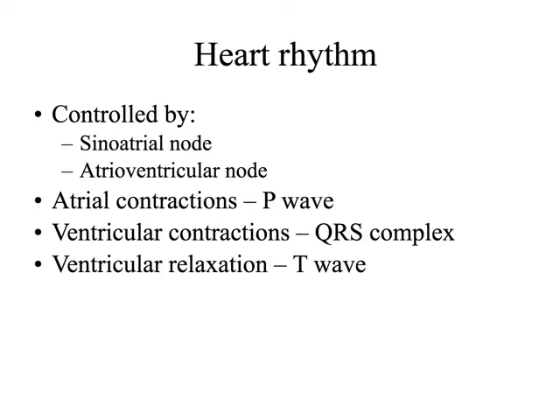They were saying that's how they gate. It's like because they have to watch the heart for so long to make sure that the heart rhythm doesn't change up and down too much. And they said they start with the P, they watch the P wave, and then the machine just looks at that rhythm, and then just sets the gating based off of whatever that was. That makes sense. It's kind of like doing abdomen MRI. It watches when they're not breathing, like when they're exhaling, before it scans. Yeah. And can I erase this? Yes, because this is a good point.